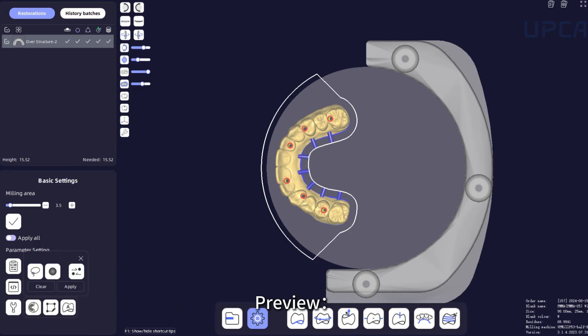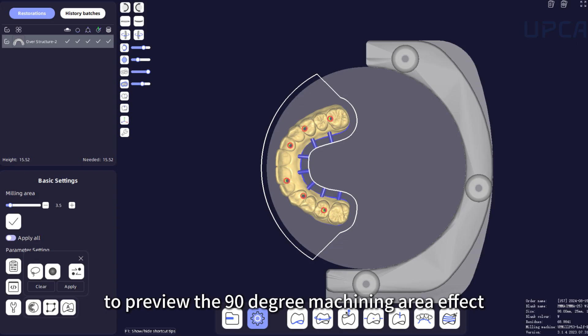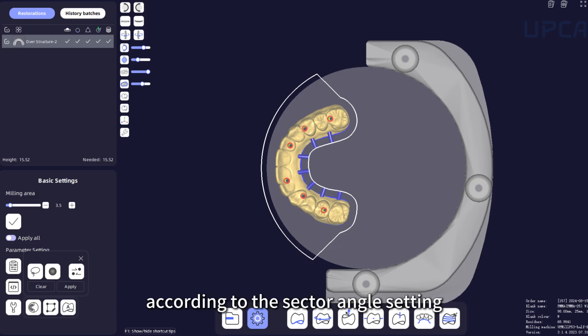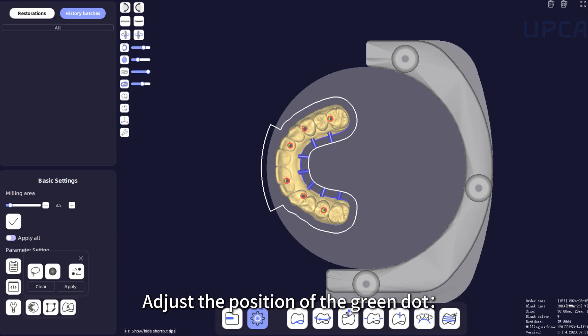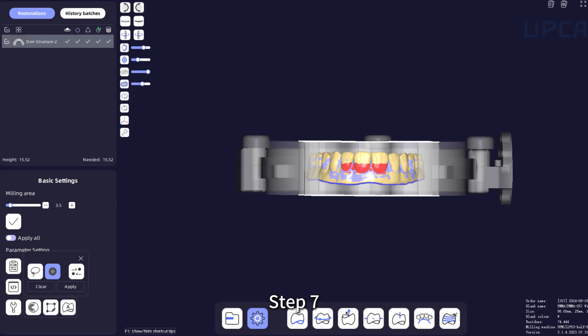Step 4: Click Preview to preview the 90-degree machining area effect according to the sector angle setting and the position of the green dot. Step 5: Adjust sector opening — drag the drag bar to adjust the size of the sector opening. Step 6: Adjust the position of the green dot to adjust the 90-degree milling range.